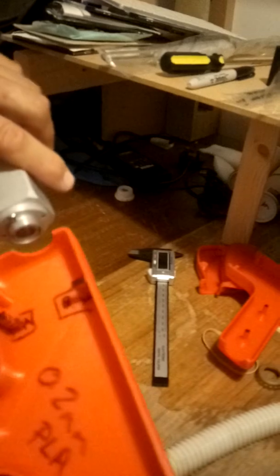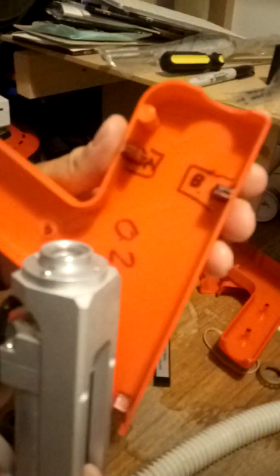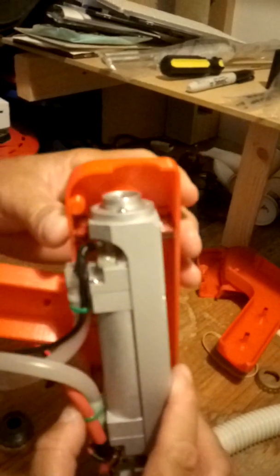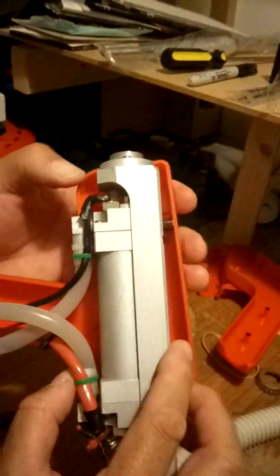Now the reason I'm showing you this is like this. That's the end that's going to come out of there. This is in reverse at the moment, like that. But I'm struggling to get this to fit inside, because Mr. A and Mr. B are just getting in the way. So I just need to trim them down a little bit, and then the rest of it will be fine.